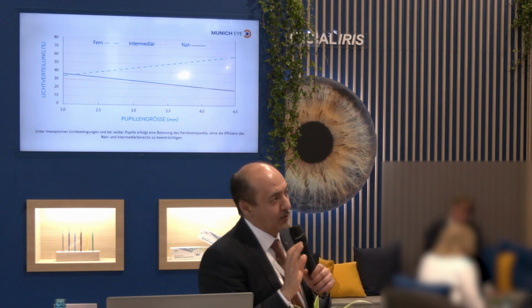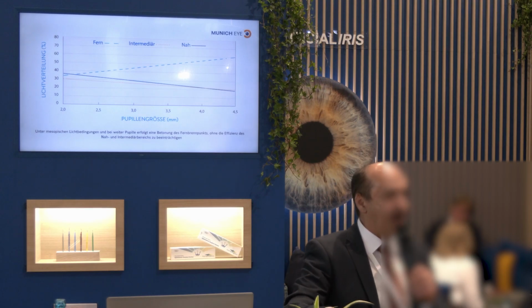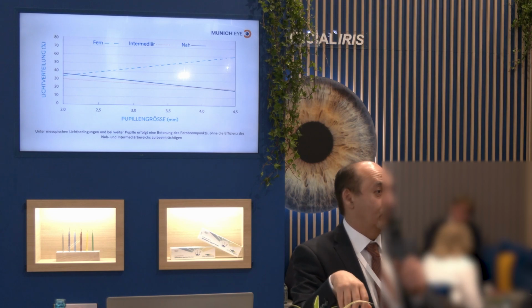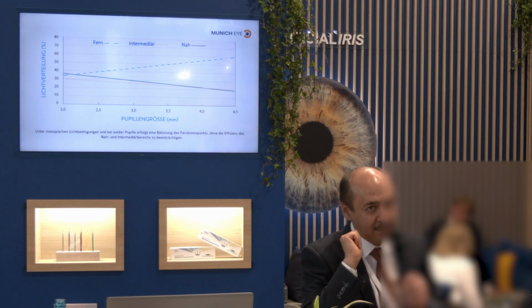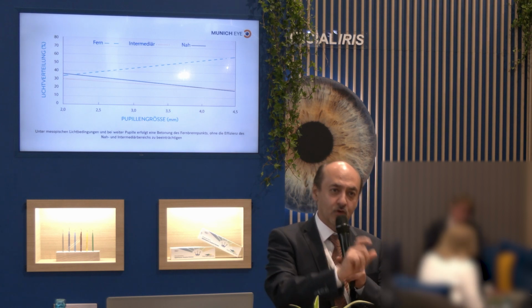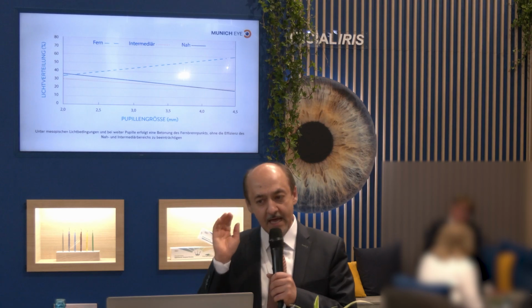That's why I think it's a bit unfair when colleagues ask, yes, the lens is great. Then the next question is with me, with cataract patients or with RLE patients. And if I have the answer here with cataract patient, it was great. With RLE patients, I haven't tried it yet. Then that says nothing about the lens. This means that clear lens must be compared with clear lens, not clear lens with cloudy lens. That is actually the unfair comparison.